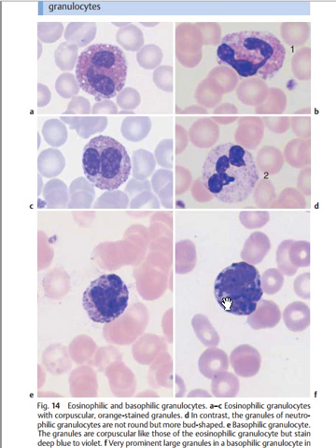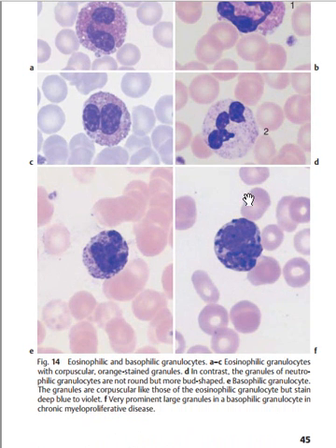Is it clear? So now diagram D. These are the different orange-stained granules which are found here. Diagram D is a neutrophil segment which is not round. So here you can visualize a neutrophil, and it's polysegmented. The segments are not oval as you can see in this case here for eosinophils.